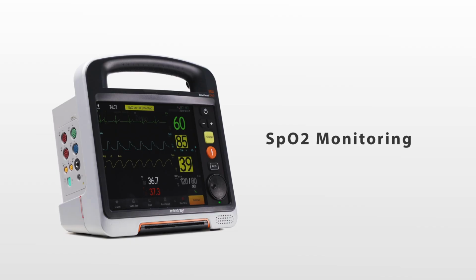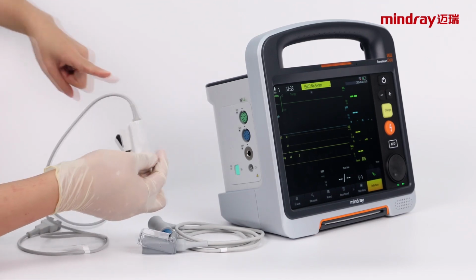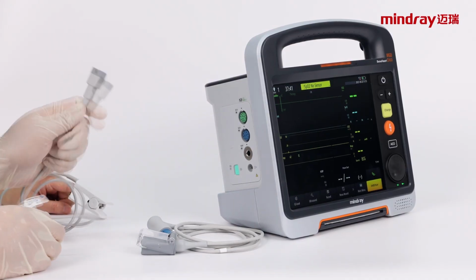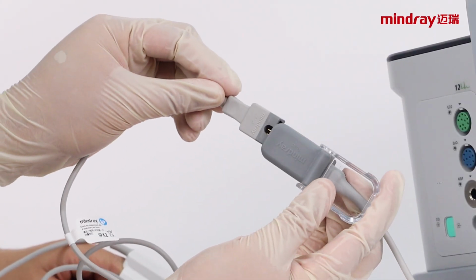SpO2 monitoring. To start SpO2 monitoring, place the sensor on the patient's finger. Connect the sensor to the SpO2 cable by first ensuring the latch is open. After making the connection, be sure to securely close the latch.